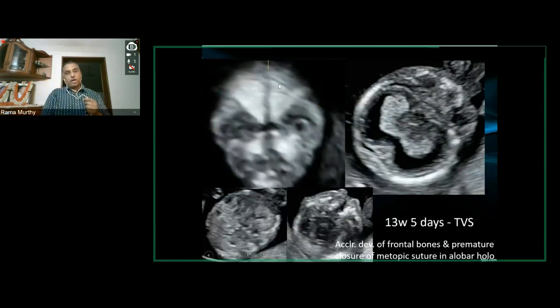And of course, needless to say, what prompted me to do this was the fact that there is a holoprosencephaly. You can see the monoventricle, the choroid plexus are continuous from one side to the other. There is no falx cerebri that you can see here, and there is a large midline cleft which is moving right into the hard palate region, the secondary palate region. And again here you have hyperechoic kidneys on either side.